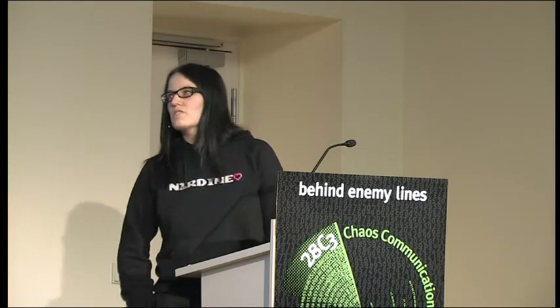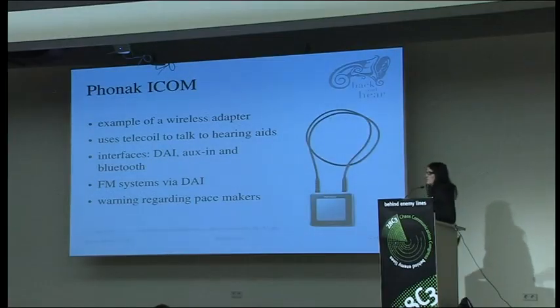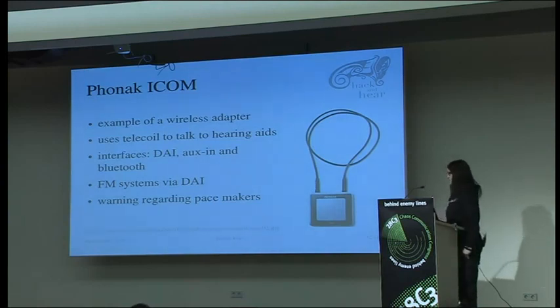Right now, if you want to use Bluetooth with your hearing aids, you have to use an adapter, and there are different versions of it. This is an example from Phonak. They built a really nice thing. This piece, you hang around your neck, and the ribbon is actually the induction loop that is used with the telecoil. To this gadget, you can connect several things. It has direct audio input, which you can use to plug in an FM system. It also has aux in so you can directly plug in your MP3 player. And it has Bluetooth. It actually also has a warning about combining this with pacemakers.